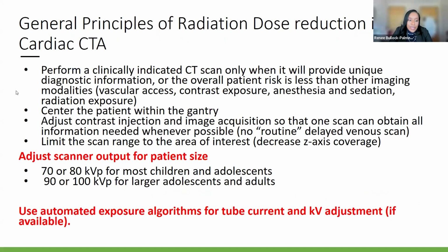So of course, when performing this study, you want to make sure that you're doing the right test for the right patient at the right time. It should be clinically indicated. You want to make sure that you're doing the test to answer a particular question, and that if there's any other modality that could answer the question without the risk of radiation, then of course that's the choice that you should go with.